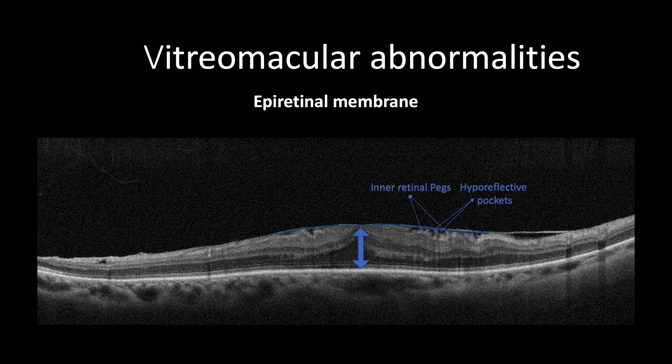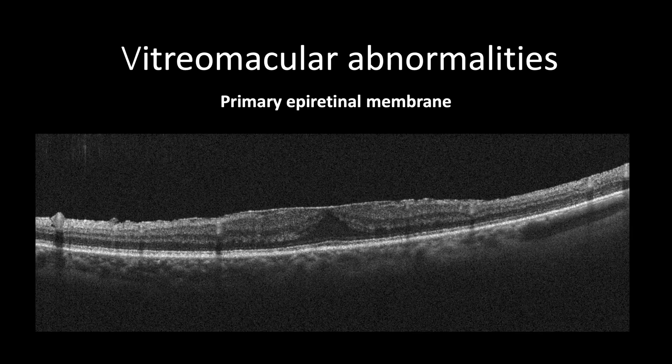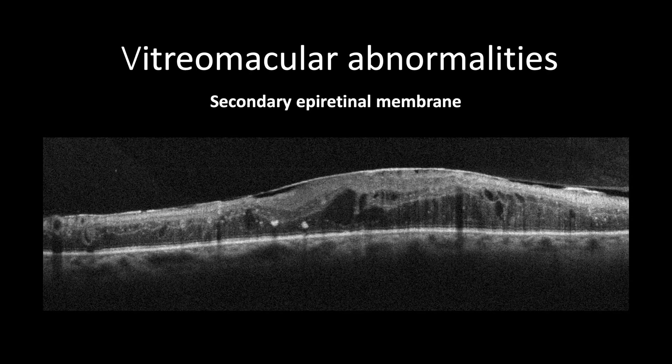The epiretinal membrane may cause increased retinal thickness and elevation of the foveal pit. It may induce folds of inner retinal tissue with or without intraretinal cystic formation or subretinal fluids. In cases where the epiretinal membrane is primary, the attachment will be broad, while in cases of secondary epiretinal membrane, the attachment will be multifocal.